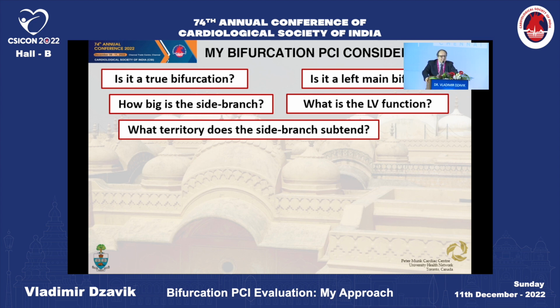Do you need mechanical support? Probably only a small minority of patients need mechanical support, but certainly, in complex left main or non-left main lesions where a lot of territory is involved, I will often have a second sheath in situ so that in case things do go wrong, I can deploy a mechanical support device. In those situations with poor LV function, I virtually always put in a right heart catheter, and PA monitoring is essential, I think, to understand what else you need to do.